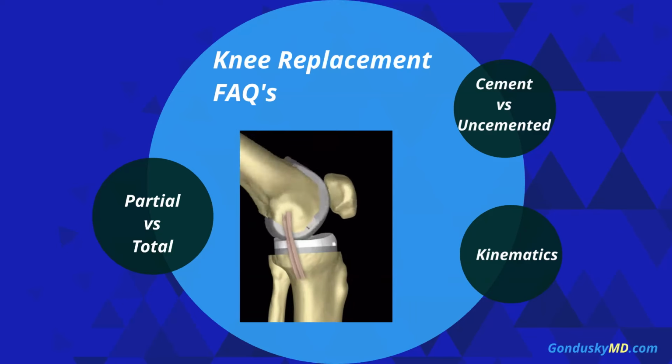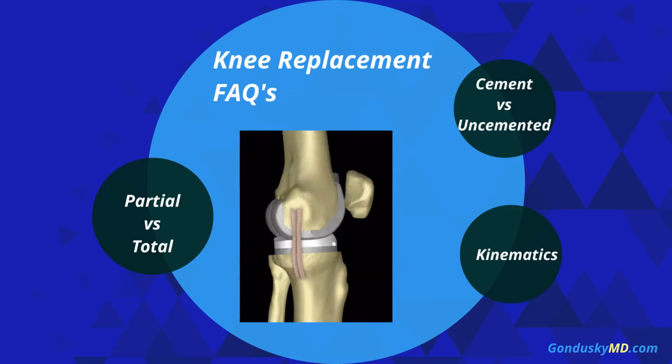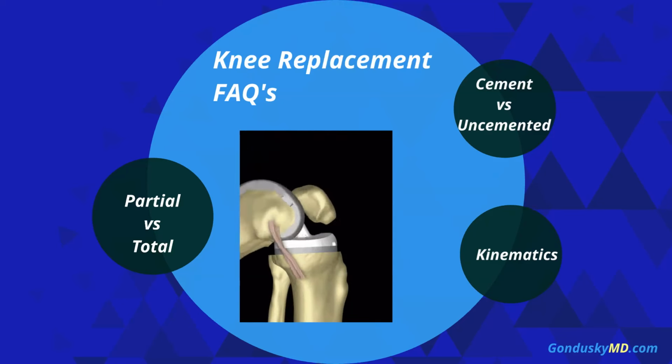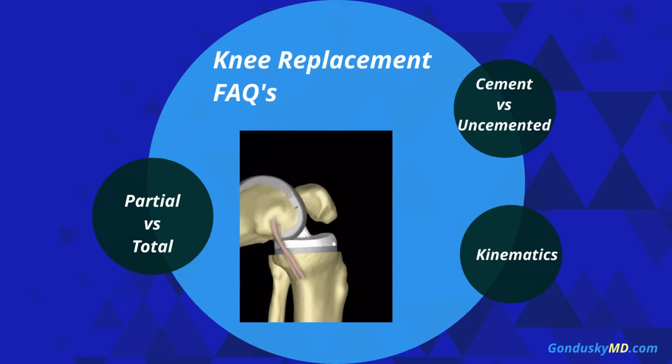So very common ones: how long will the knee replacement last? Knee replacement has been engineered over about 50 years. So knee replacement has gotten better and better and better. And there's a ton of misconceptions about how long knee replacement will last. Of course, it depends on what happens to a knee replacement.